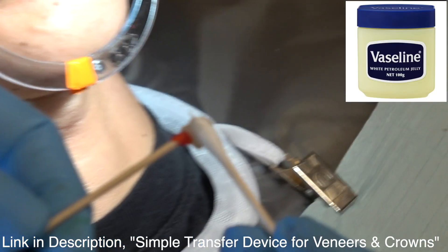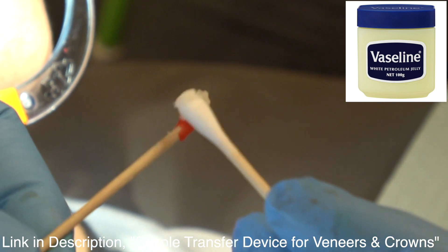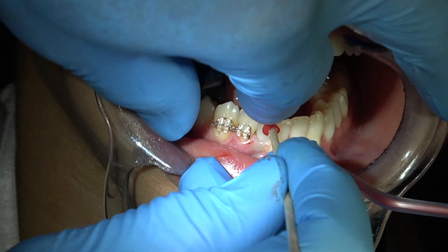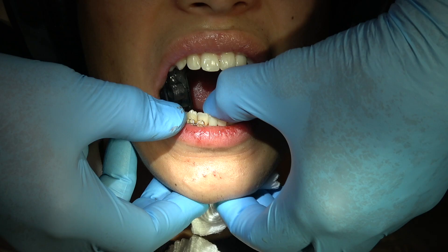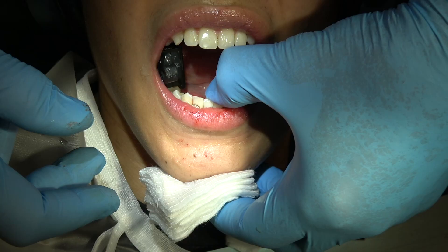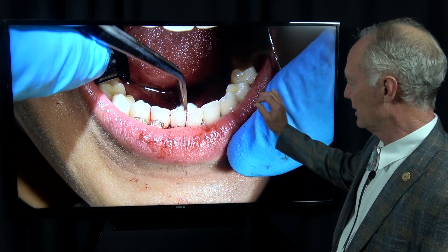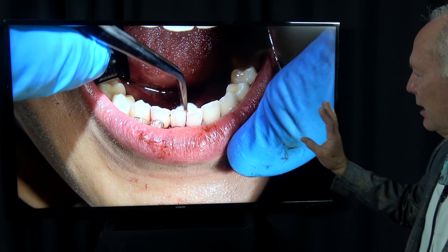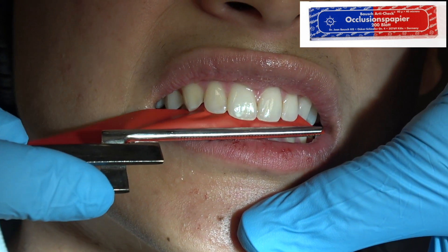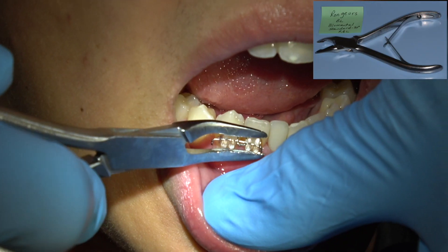I'm going to polish with these Shofu rubber wheels, then alcohol the crown and place Vaseline on the interproximal surfaces of the crown. Final cement. Pop floss through the interproximal contacts before the cement sets, because you don't want it to set up on the interproximal surfaces. Wipe it. Don't remove the final cement until it has initial set — you want it to peel off, not wipe off. I talk about that in all my crown and bridge and veneer videos. You never want to wipe it off; you want it to peel off. If the patient leaves that day, no contact on the restoration.